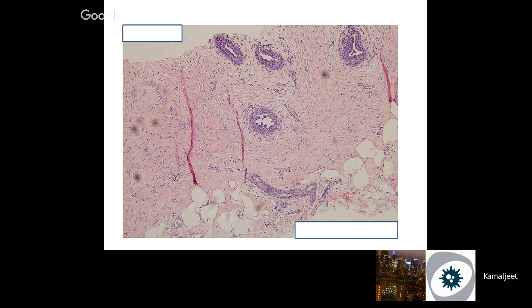which are different from the micropapillary ADH. The nuclei get smaller as you go into the lumen. The nuclei are broad at the base, and they get smaller as you get into the lumen. Many nuclei you'll see are lying flat, parallel to the basement membrane. That you also see in this gynecomastoid UDH. At the same time, you'll also see this PASH-like, very cellular proliferation in the stroma. So the overall changes in the stroma and the duct make it gynecomastoid, or gynecomastoid hyperplasia in a female breast.